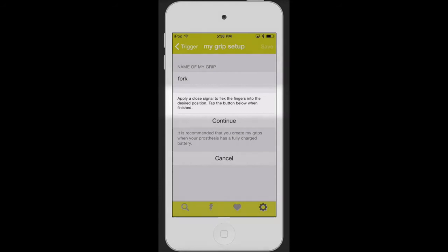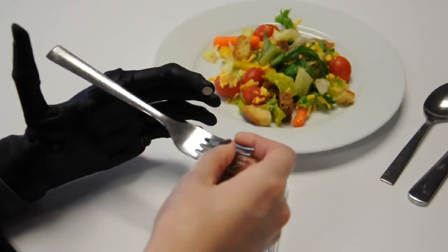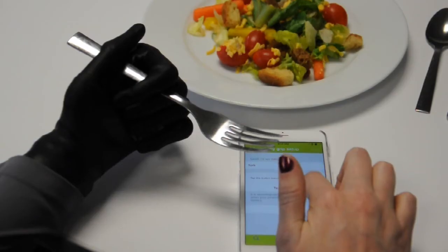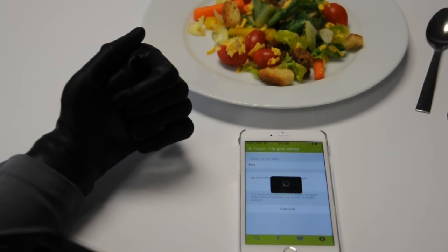After pressing Continue, the next closed signal will close all fingers around the desired object. Once the desired position is achieved, press Test to open the hand and activate the new MyGrip position.